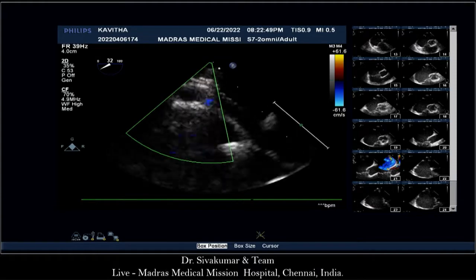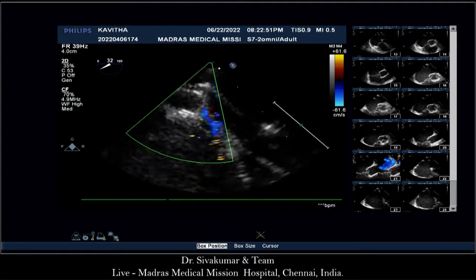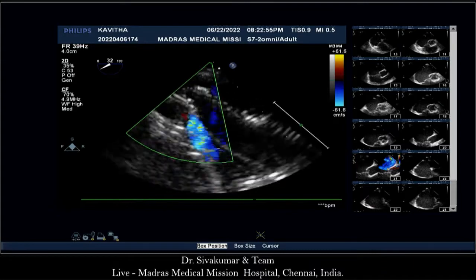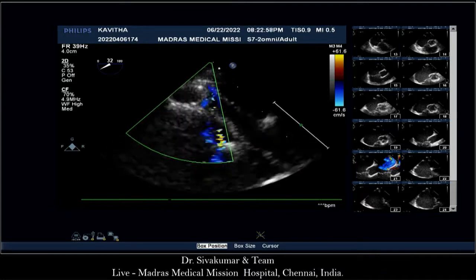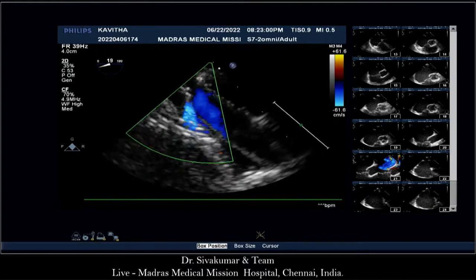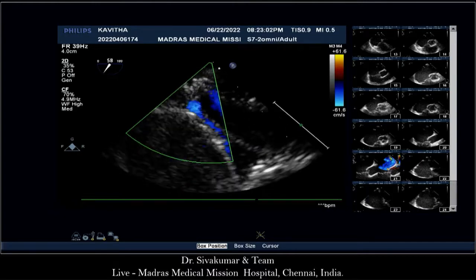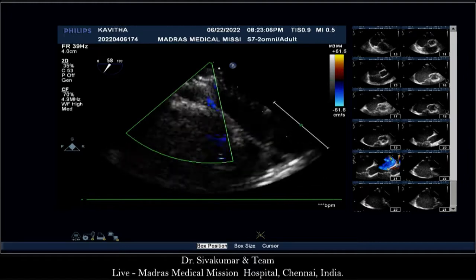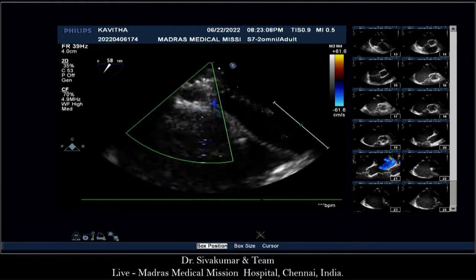Shiva, what we need to see here is a mitral valve. Yeah, we'll show every margin. Now I'm concentrating on the postero-inferior. Now keep going down, 50, 60. I'm going down. Perfect. Okay, now push it inside a little bit. Slightly retroflex. I'm able to see the inferior margin. That's fine. Okay, now come to 90 degree.